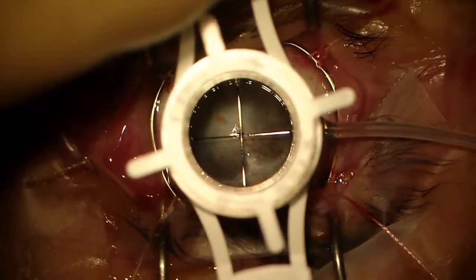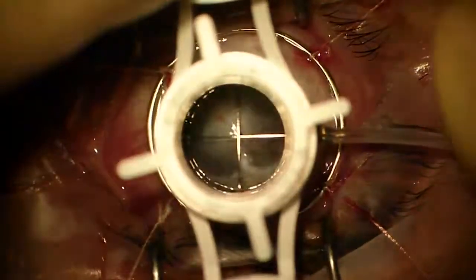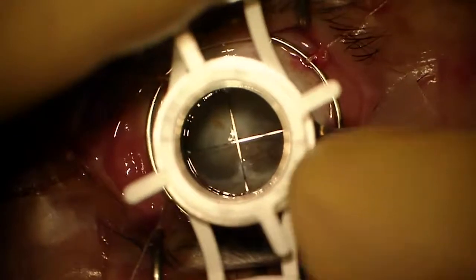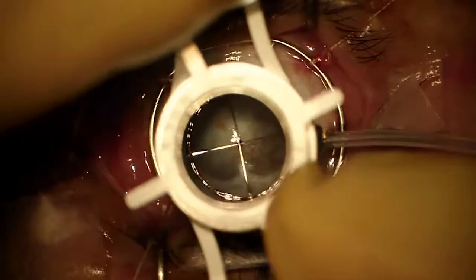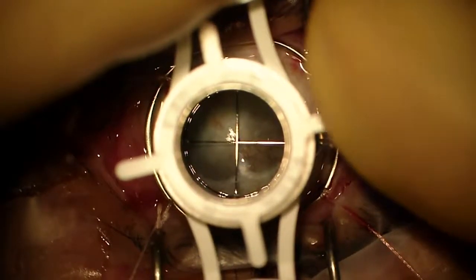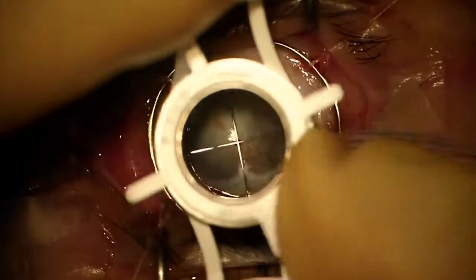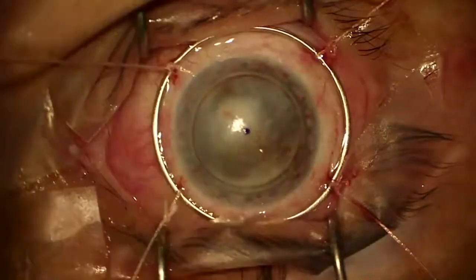Suction on. One, two, three, four. That puts us at the corneal surface. 5, 6, 7, 8. We're now about 250 microns into cornea. I'm going to go another 120 microns. 1, 2. We can expect some bleeding because she's highly vascularized.